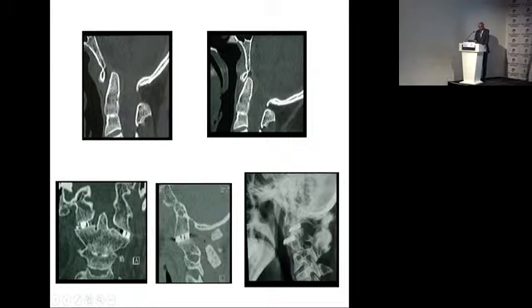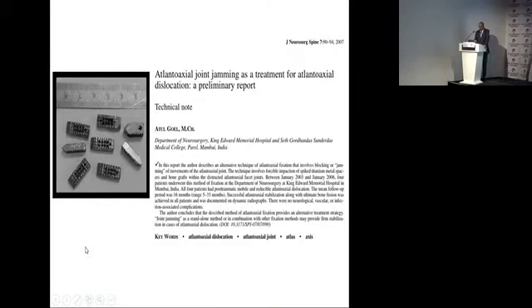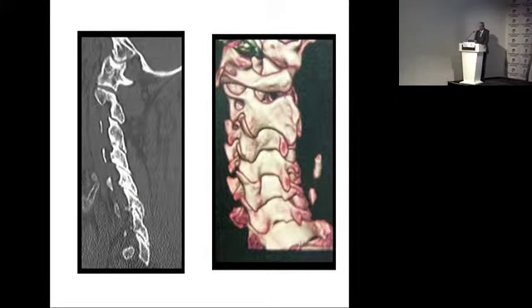So then our intra-articular spacer technique, as you know, has been used for a number of situations. The bottom line is understand instability. Understand that instability is the problem and all other issues are consequences of instability. That is the bottom line of understanding. And this is what I want to show you for cervical degeneration. Cervical facets we have never exploited for treatment.